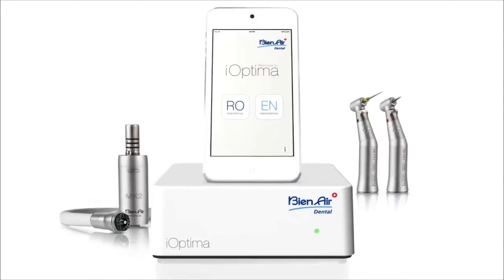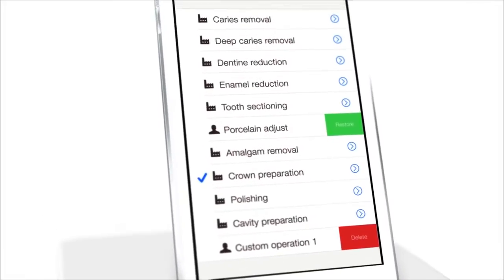When I do Crown and Bridge, I use a certain setting for my basic prep and a different setting for my margin refinement. One of the problems I see with electric handpieces is the dentist buys one, is used to an air turbine, steps on the gas, and runs at 200,000 RPM for everything — but the whole point of an electric is you can modify all these things. I was told it will remember my settings. The user interface is the iPod Touch, designed to accept as many user settings as the memory will hold — more than any dentist will ever use. It creates a one-touch feature allowing you to switch from high speed to slow speed with one attachment, which is also a Bien Air first.